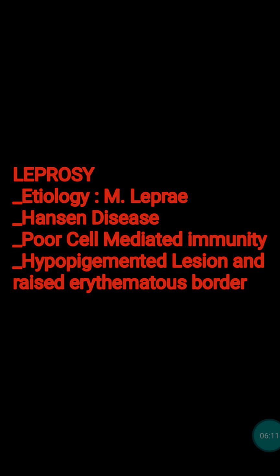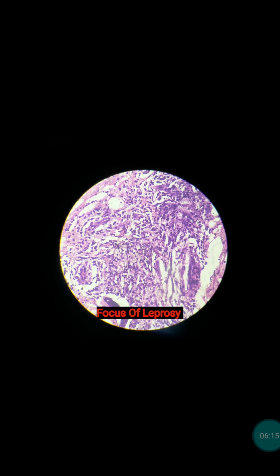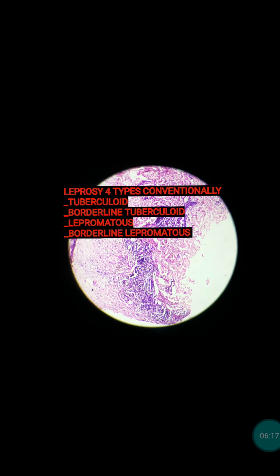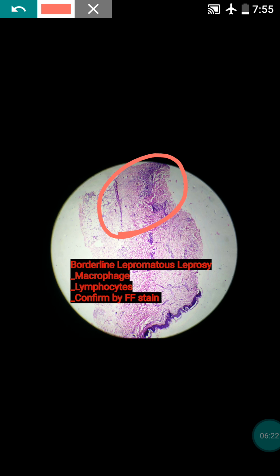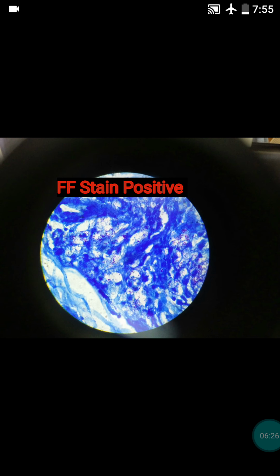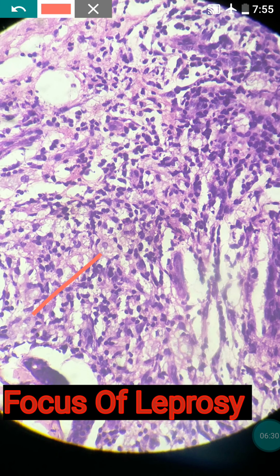So this was regarding the diagnosis of leprosy. Again, I am summarizing. You have to look for the focal collection of macrophages. This is the focus of leprosy. If you inspect it in the 40x view, you can see the macrophages, cells with clear cytoplasm, and many lymphocytes, the small round cells.